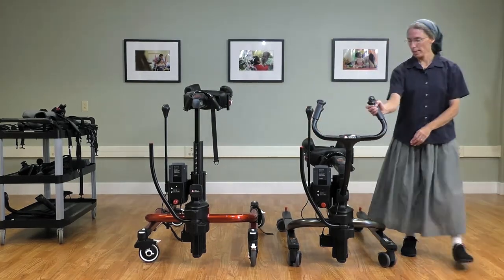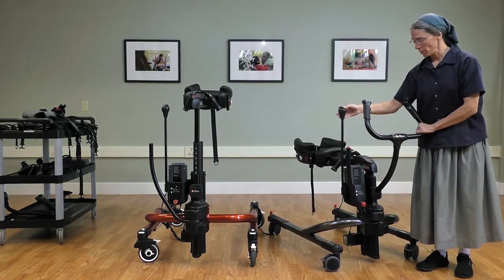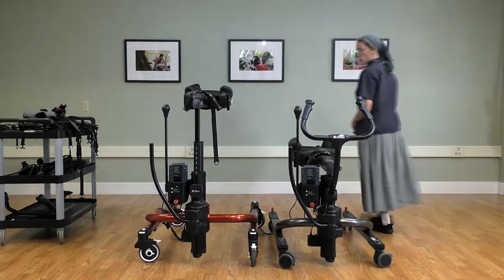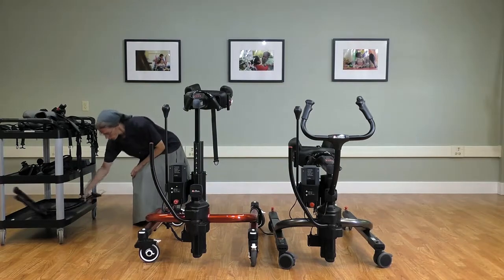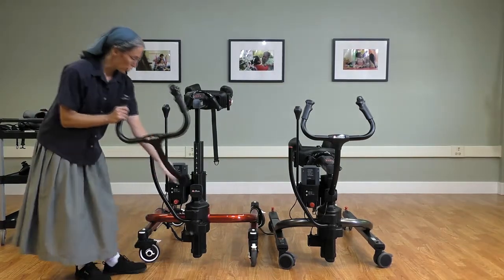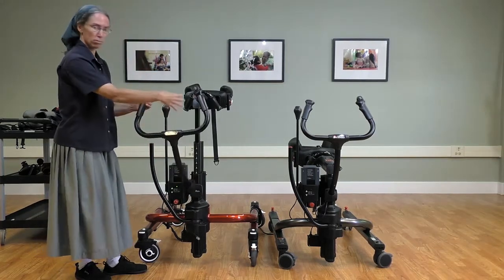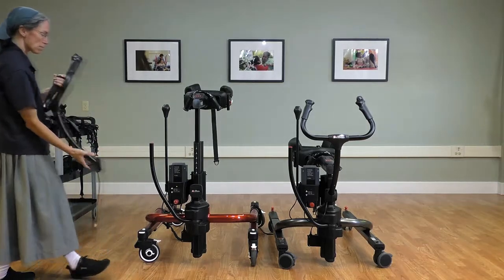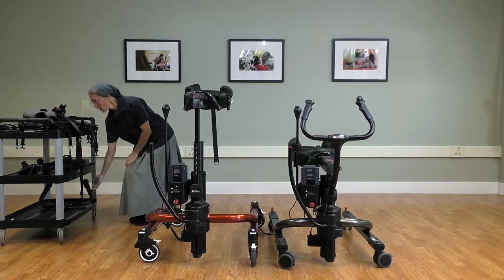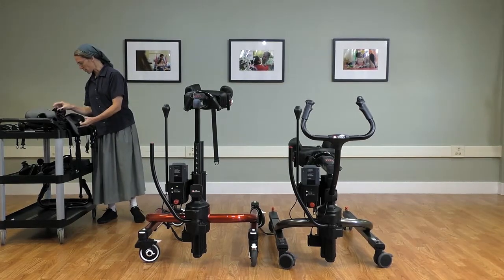Note that we can now get the switch pole as an option for the tram, and the caregiver handle is an option for the E-Pacer. There may be a client where you would want to attach that at the front for gait training or transfer purposes.